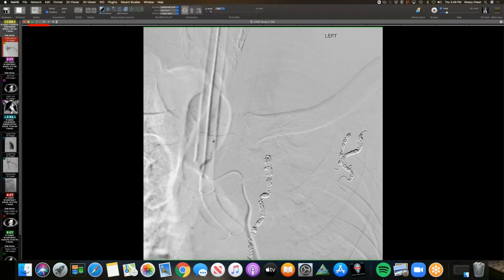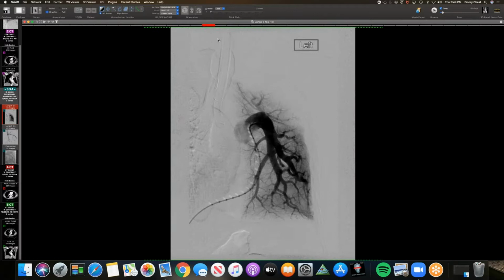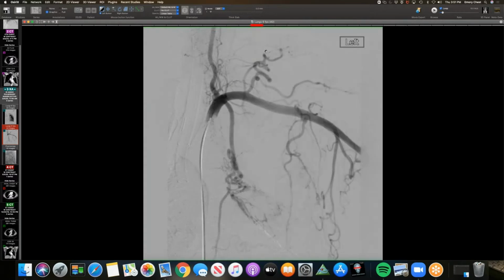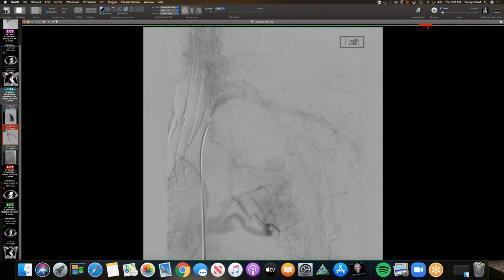Interesting. It looked like on the first angio, was it draining somewhere funny? There was some big vessel draining centrally. So the first one is this one. The one from the pulmonary? No, the systemic arterial. Yeah, you kind of see it, but it's really late. It's really down low, just below that big tangle of vessels. There's a big tortuous vessel draining back towards the mediastinum. You wonder if that's a pulmonary vein, but I agree. I was just curious if they sorted out what that was.